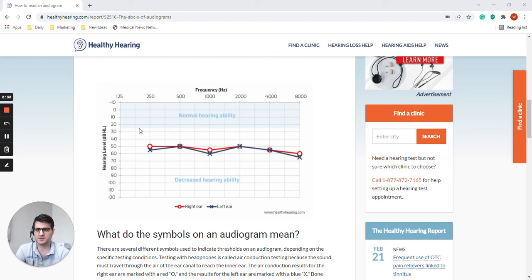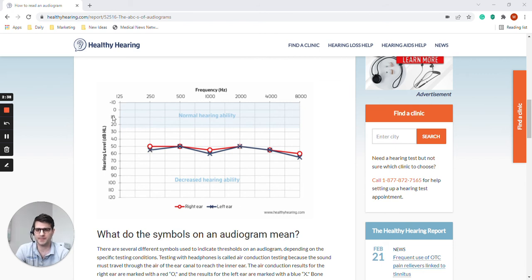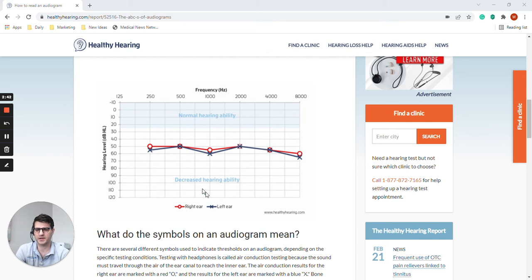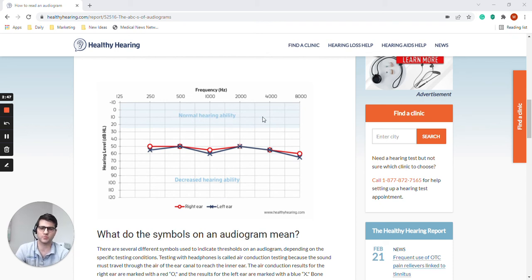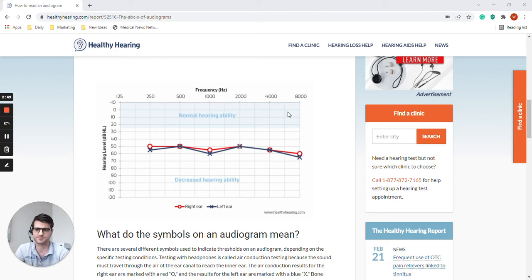As you can see here, there's a shaded region at the top that's marked out that says normal hearing ability, and below this line it's called decreased hearing ability. This would be considered normal hearing. If these results were plotted up here, this person would have had what we would call normal hearing.